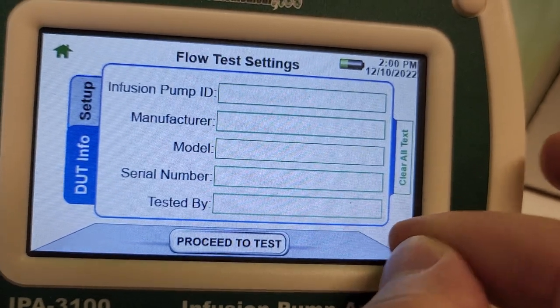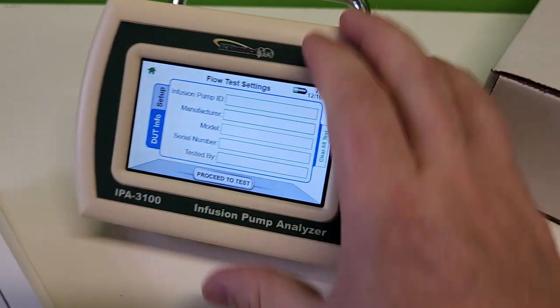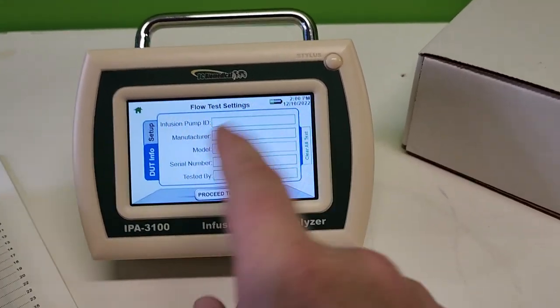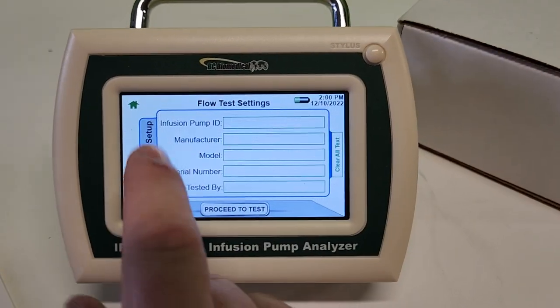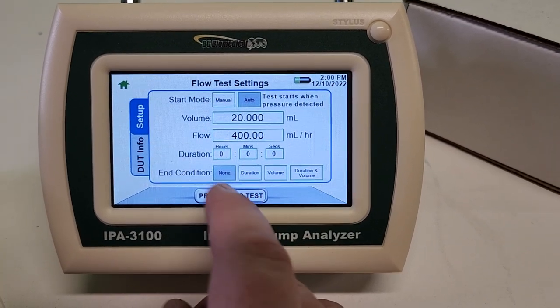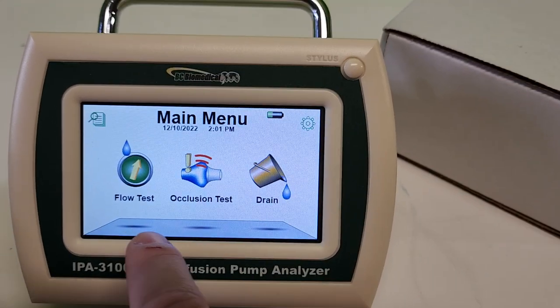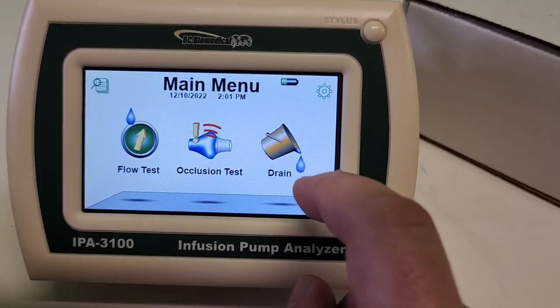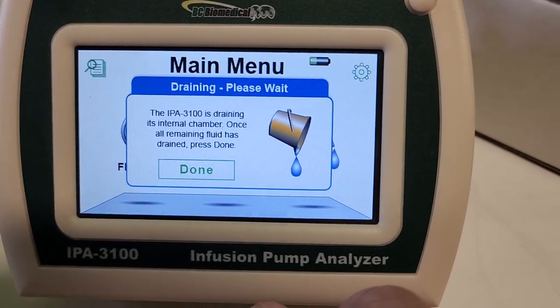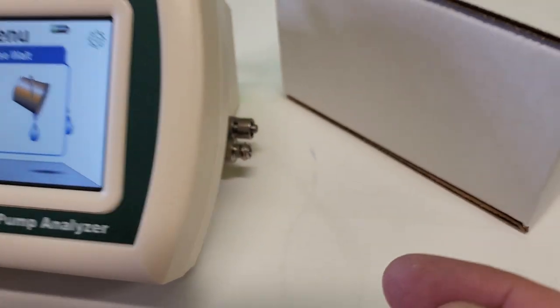It's a resistive touch screen so you have to touch it a little more firmly, but since you're going to be around fluids it's probably a good idea - with capacitive screens you can get a lot of misreadings around fluids. Let's go back to setup and then home. We have flow test, occlusion test, and drain. The IPA 3100 is draining its internal chamber - once all fluid is drained, press done.